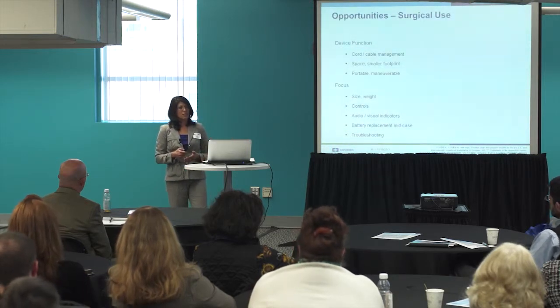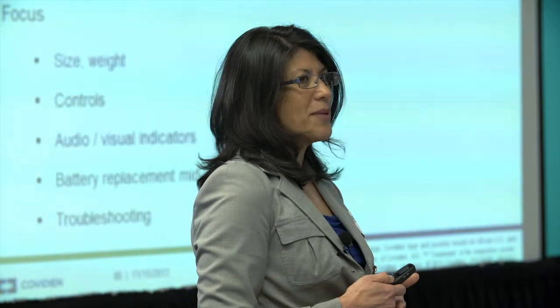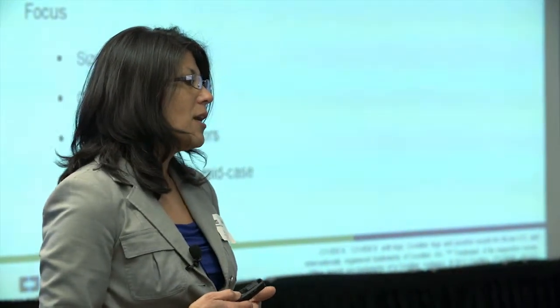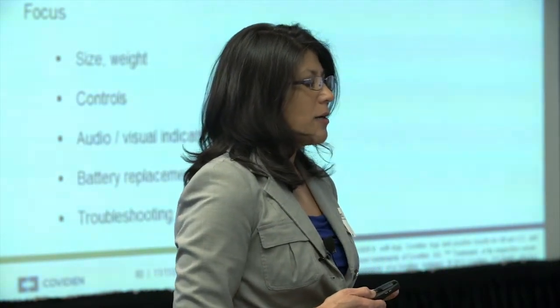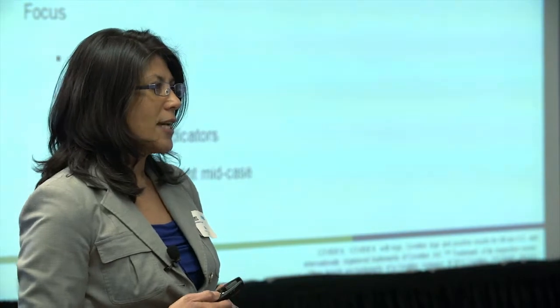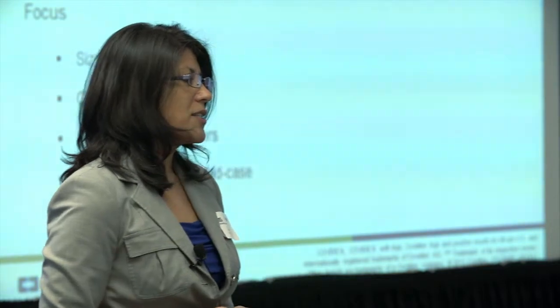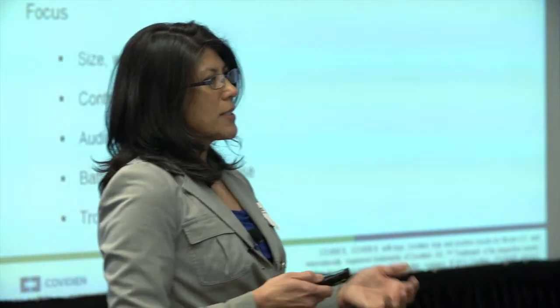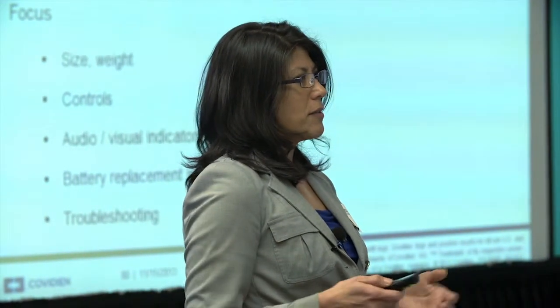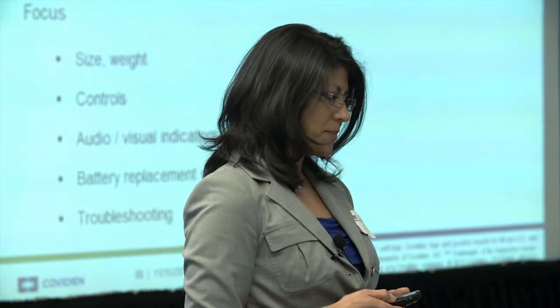The design considerations themselves, we looked at form factor, and this is where we brought in industrial design. Somebody had mentioned using industrial design earlier. So that was a key component to actually making the device attractive. We had to look at weight. Battery technology, when we started developing the device, it's still evolving. And so that was our biggest concern, was could we get the product in a form factor that would be acceptable to our surgeons if they had to use it for longer than an hour. Some surgeons' cases can go 8 hours in a really long case.